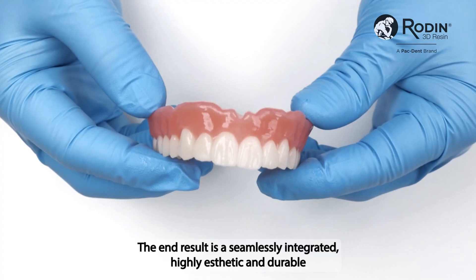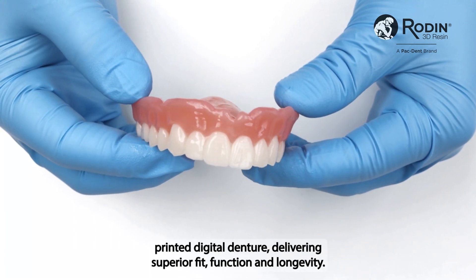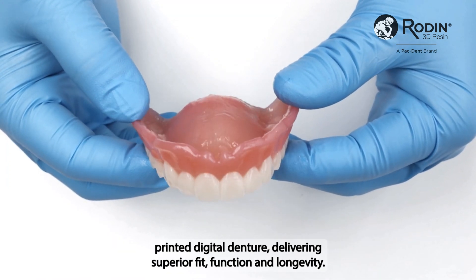The end result is a seamlessly integrated, highly aesthetic, and durable printed digital denture, delivering superior fit, function, and longevity.